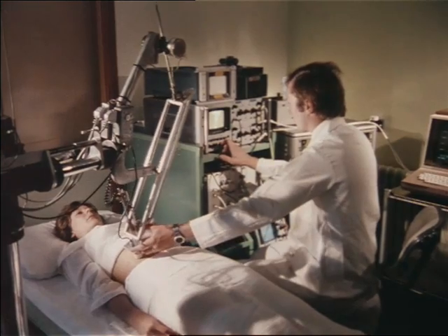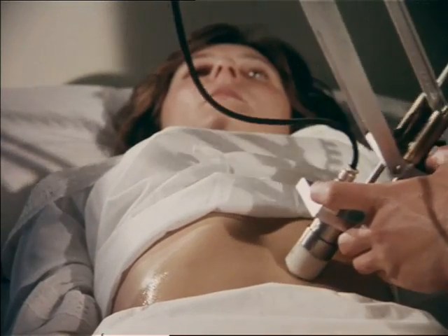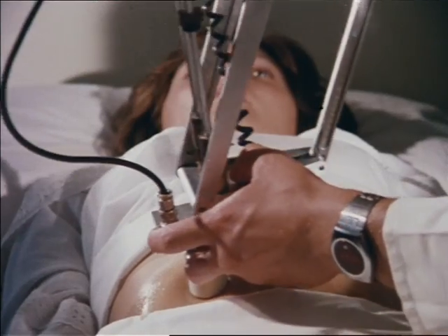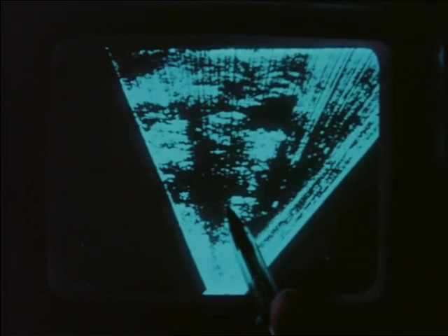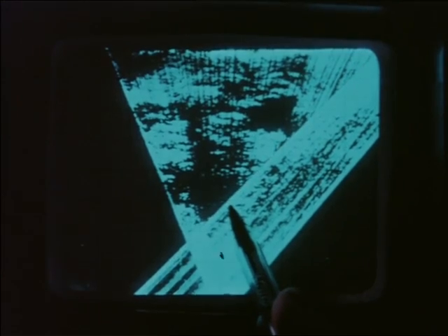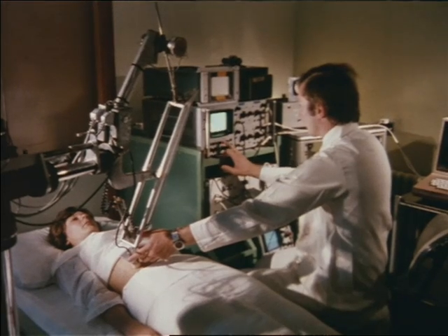This is a sort of ultrasound microscope. A transducer, the source of the ultrasound pulses, is swept across the patient's stomach. The reflections build up a picture of the major structures of that part of the body. Then they select a single point of the image consisting perhaps of just 100 cells. The arm carrying the transducer is adjusted so the beam will cross this selected point. As the transducer sweeps to and fro in its new position, the ultrasound beam always passes through that point under examination. All the reflections are produced from the one cluster of cells.